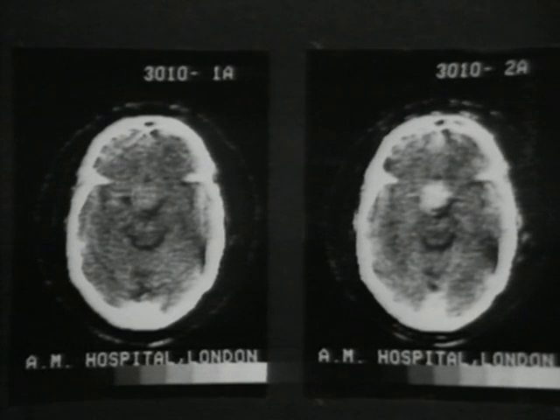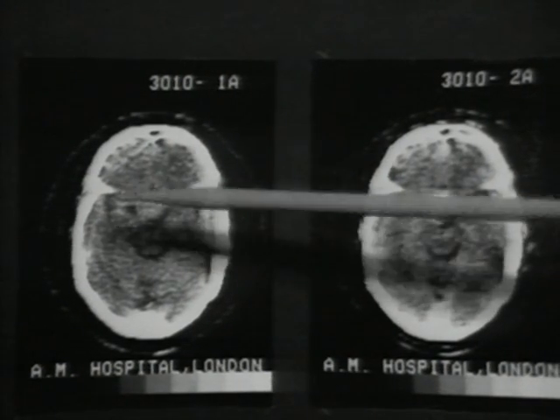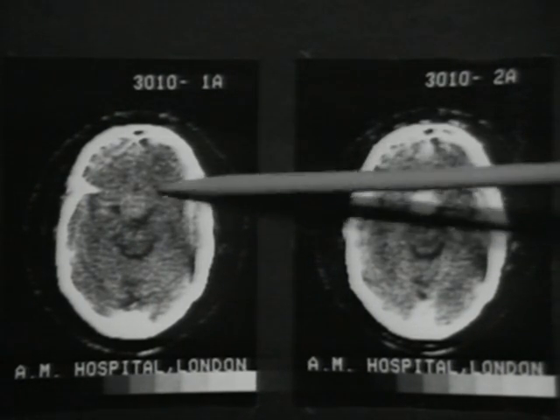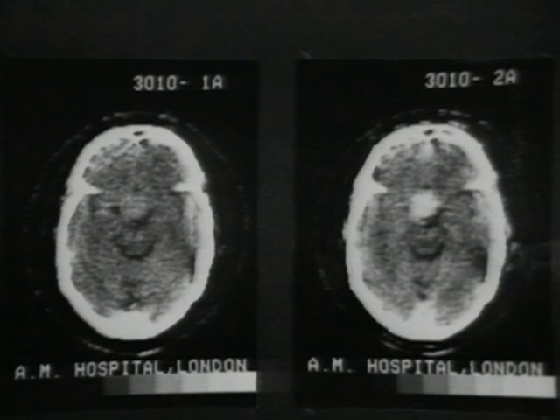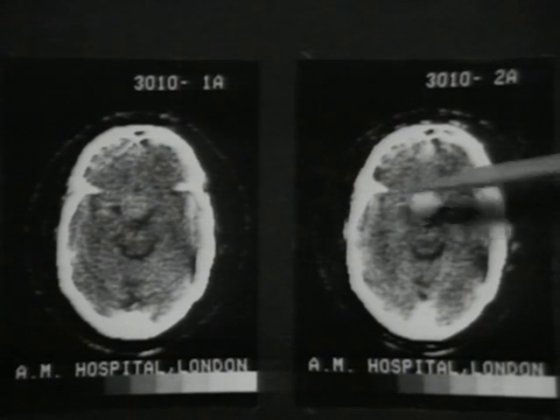Now, with attention to correct scanning technique and arranging scans to coincide with areas of interest, tumors in and around the pituitary fossa may be identified. Here is a patient with a large pituitary adenoma. In the first scan, we can just see the tumor protruding above the pituitary fossa and deforming the chiasmatic cistern. It is not really very dense, but if we give the patient 60 milliliters of Conray 420, the density is considerably enhanced. This is of value when the tumors are small or difficult to identify, and we could easily imagine a situation where we could see a small asymmetric tumor rising out of the pituitary fossa.